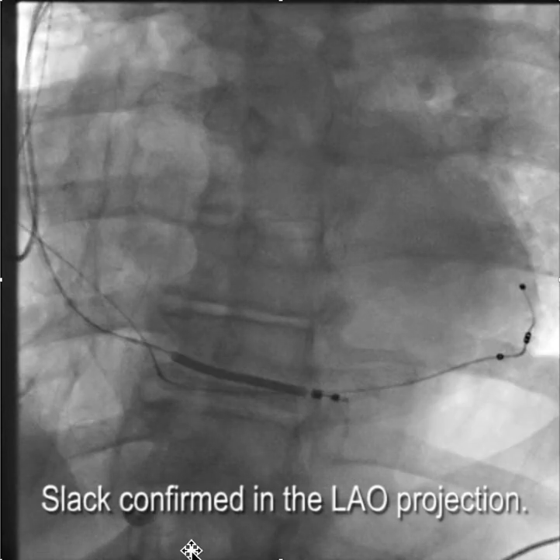Once we got started with the Worley system and the table turned perpendicular, the whole implant probably took about 20 minutes, whereas the first implant was a couple of hours, and again another couple of hours utilizing industry tools until we went after it with the Worley system. So this doesn't actually take time — it actually saves time. I hope you find this useful.